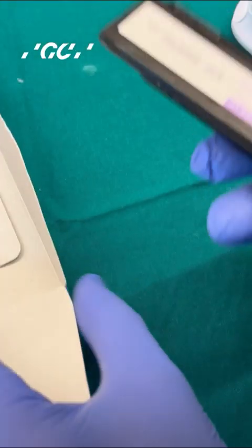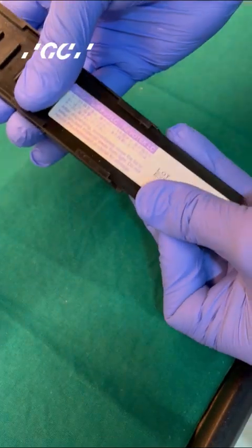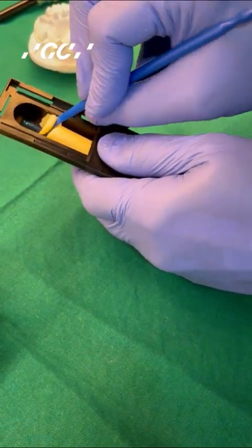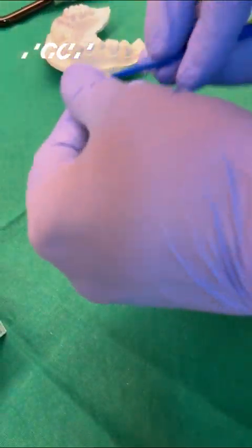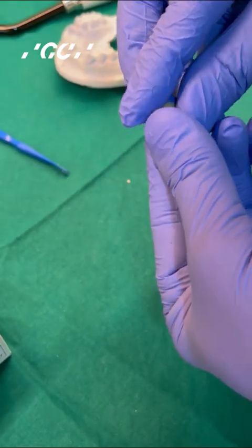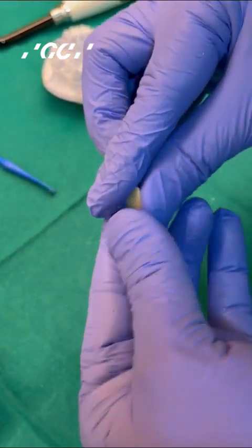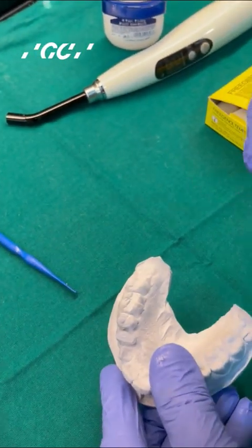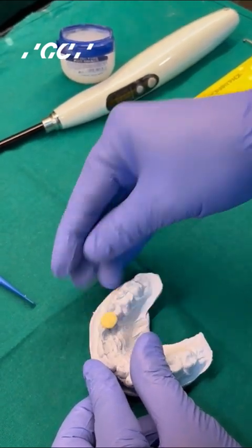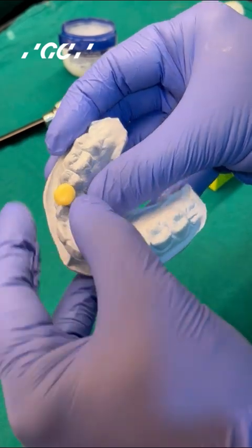The material Revotec LC is a single component resin. Take it out from the pack — this is what it looks like. You have an instrument along with the material, which is a blue colored spatula used for taking the material as well as for carving the tooth. Take out a little bit of material; this is a resin that can be mulled in your fingers, unlike other composites which we do not mull. Soften the resin and then place it on the occlusal surface of the tooth that you have prepped — whether in the patient's mouth or on the model.